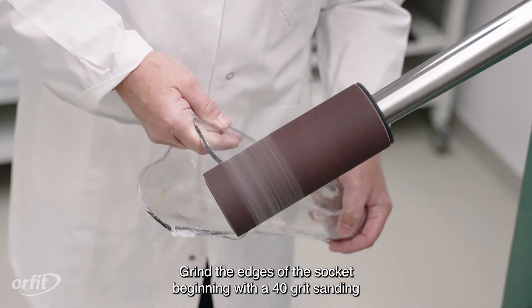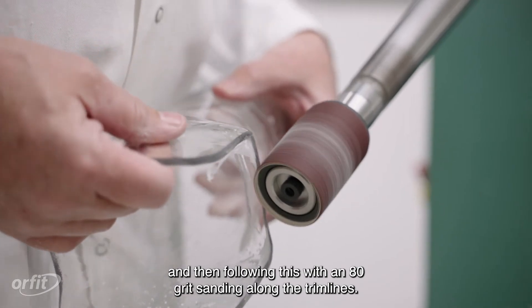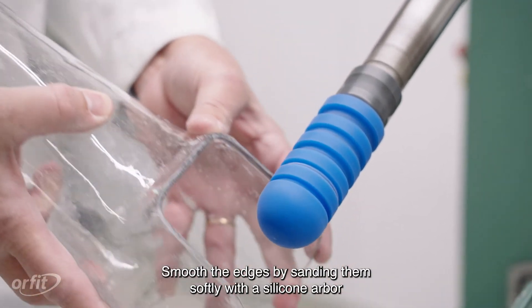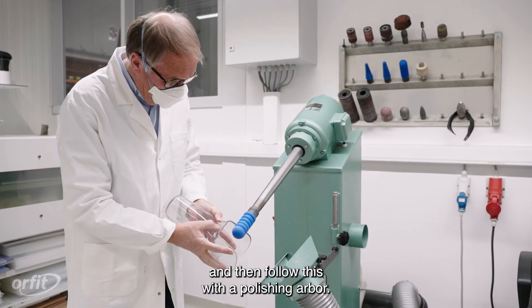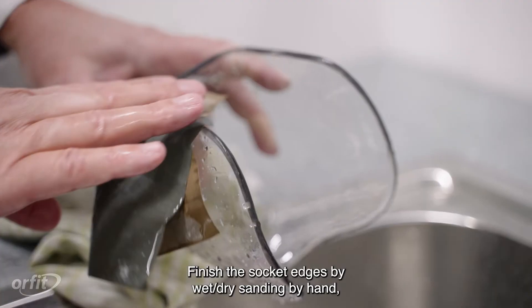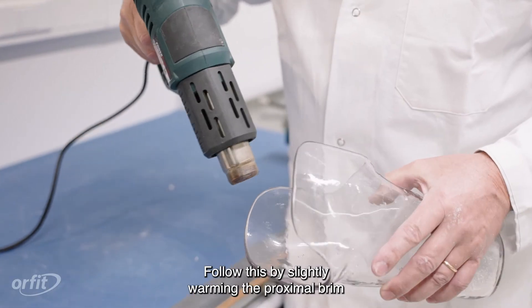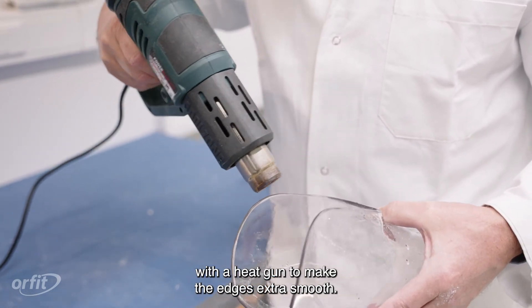Grind the edges of the socket beginning with a 40-grit sanding, and then follow this with an 80-grit sanding along the trim lines. Smooth the edges by sanding them softly with a silicone arbor, and then follow this with a polishing arbor. Finish the socket edges by wet-dry sanding by hand with 500 to 1000-grit sandpaper. Follow this by slightly warming the proximal brim with a heat gun to make the edges extra smooth.